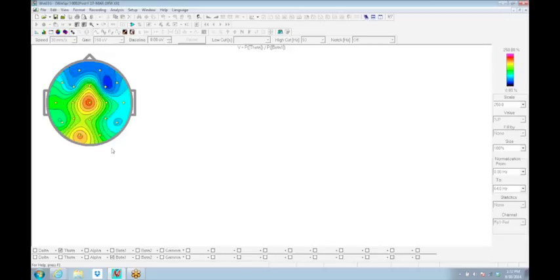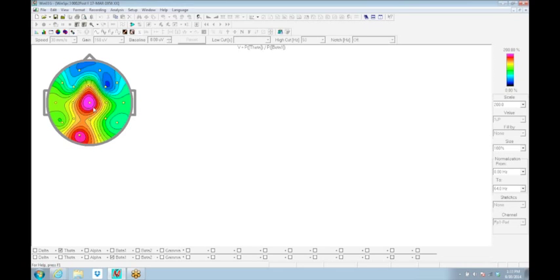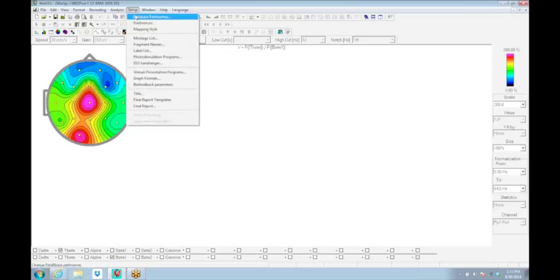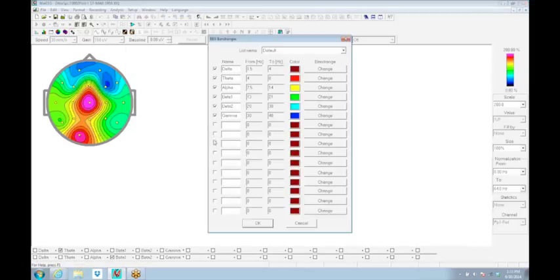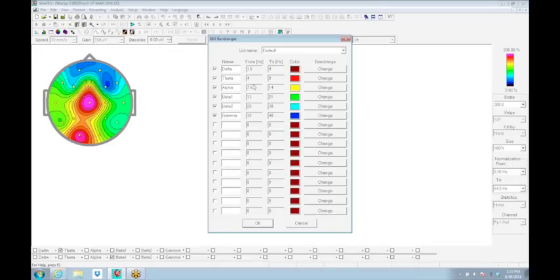The theta-beta ratio, if I get this to purple up a little bit, is 200 percent, which is two to one. A ratio of two to one isn't a terribly high theta-beta ratio. Although we know we had some theta at that location, there also was enough beta to keep the ratio from being very high. Here, under setup, band ranges, you have to make sure that your theta matches the theta-beta ratio, theta, the four to eight, and beta 13 to 21. That's the way to match to get theta-beta ratio.